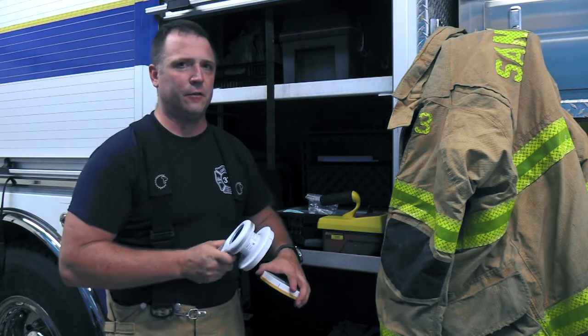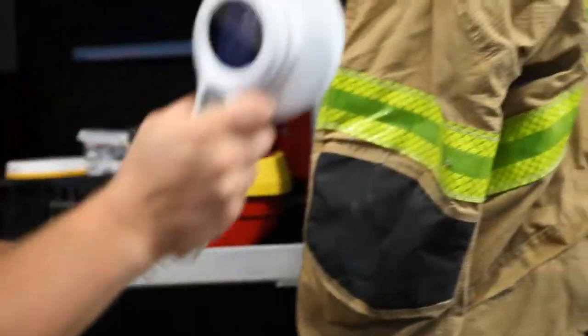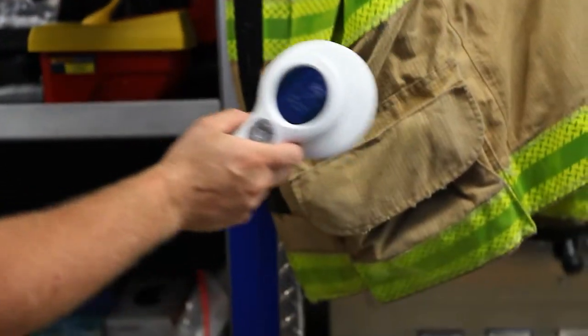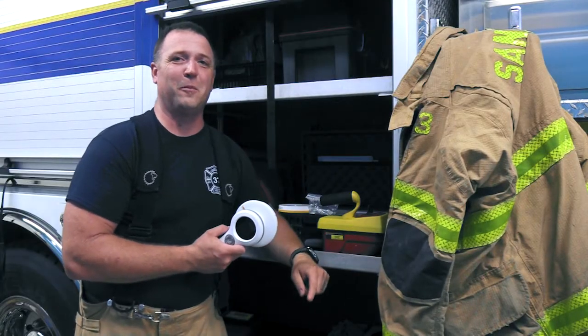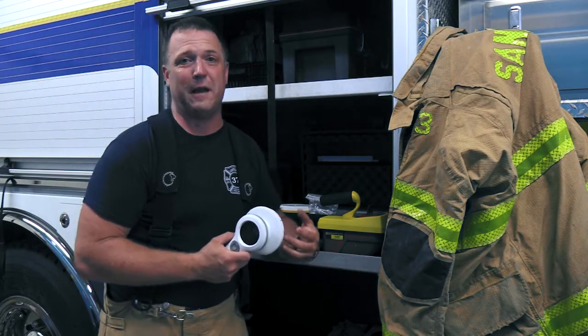Let's take my jacket, for instance, which we exposed to a radiation source earlier today. I'll put that cap on, get my counts and energy levels, and simply go around my jacket. I also mentioned we can set alarm rates, so that we know if we're in a high-level area where we need to immediately evacuate ourselves.